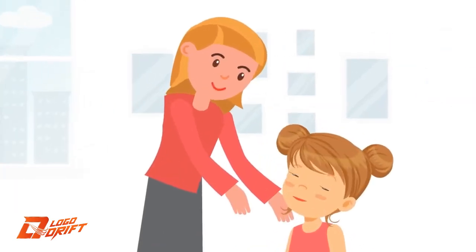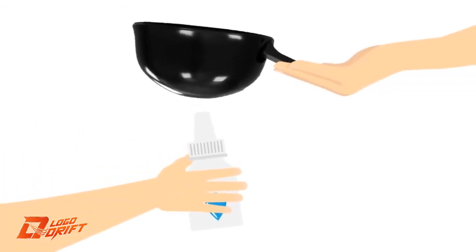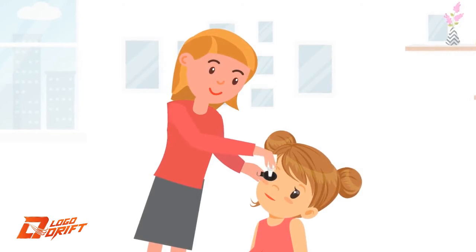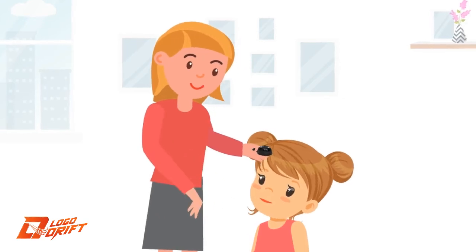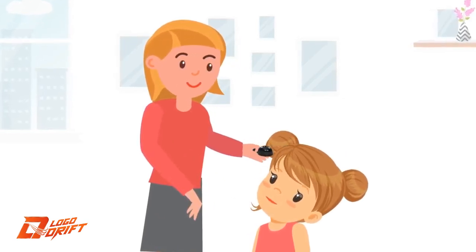Have the individual sit down and look up at the ceiling as far back as they can. Pick up the Easy Drops applicator, turn it upside down, and place the nozzle of the eye drop bottle into the Easy Drops applicator. Ask the individual to look away at the ceiling, then gently place the Easy Drops applicator on their eye.